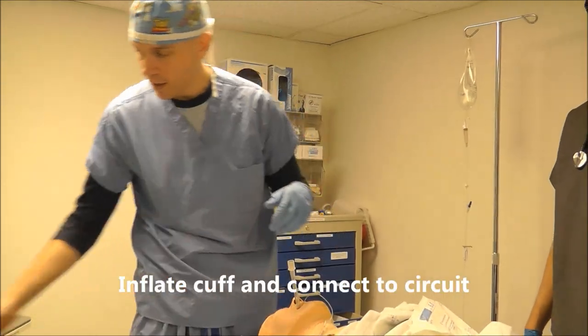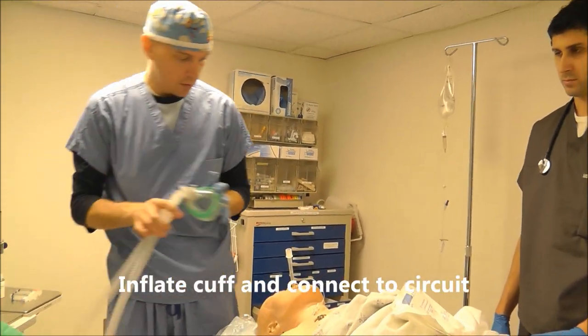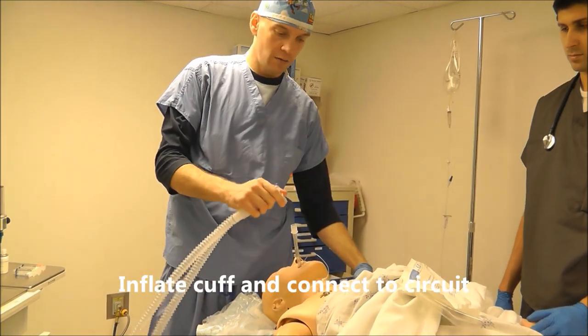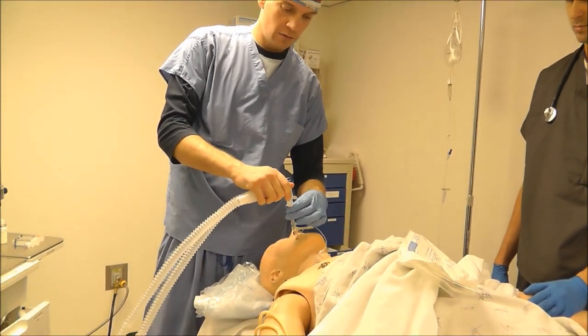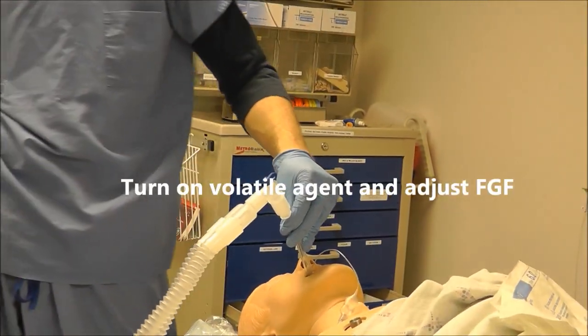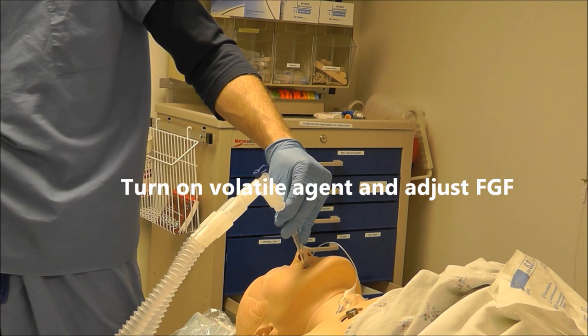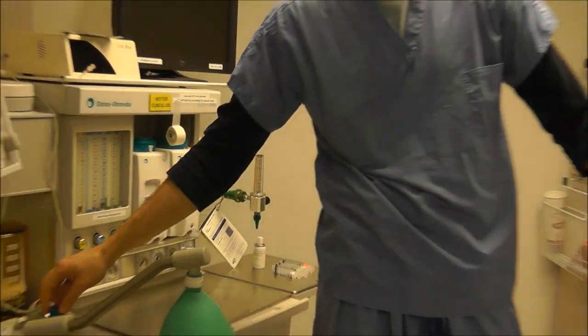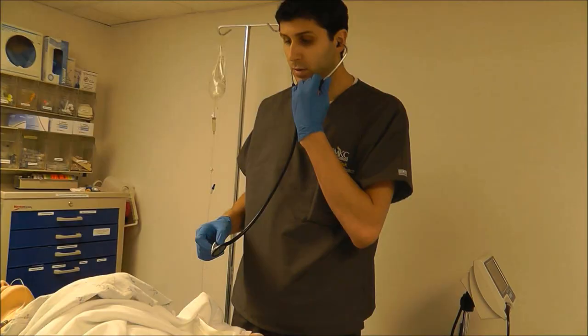We'll go ahead and inflate here, hook up our circuit, and then I'm going to turn on sevoflurane because I want the patient to stay asleep. Then it's time to check for breath sounds.